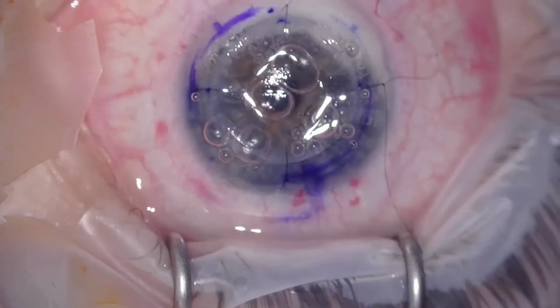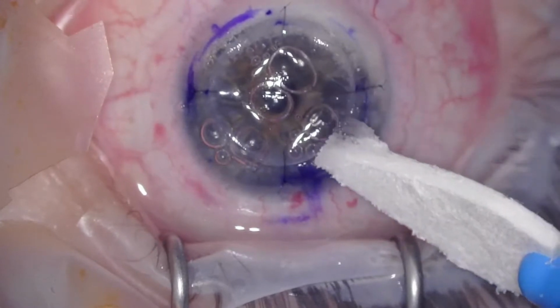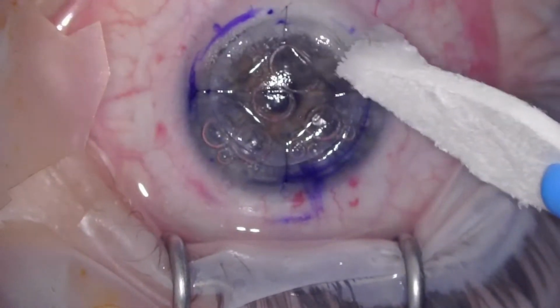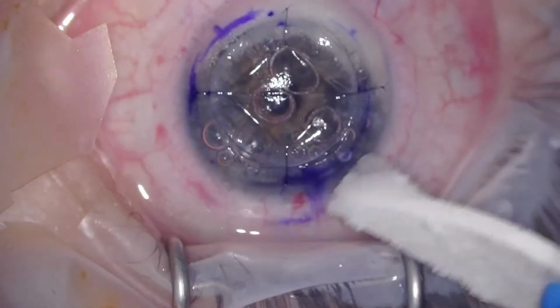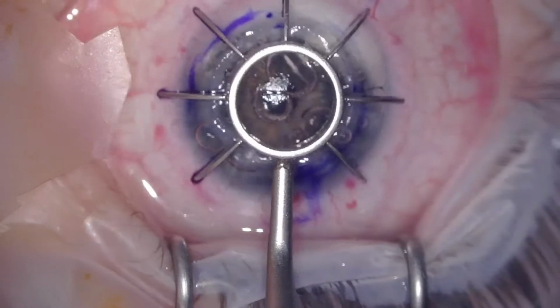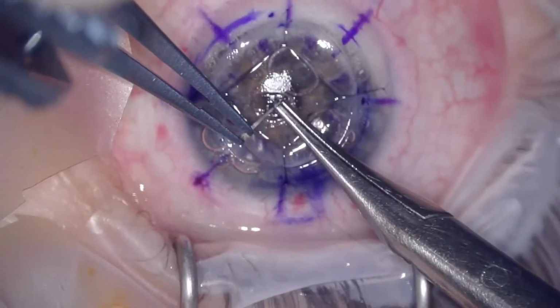I usually use a 15 blade to trim the sutures to allow more accuracy. And now I'm using the spear just to dry the edges, removing any residual viscoelastic and exposing that diamond. And now I'm using a star marker just to mark the remaining marking points for the sutures.